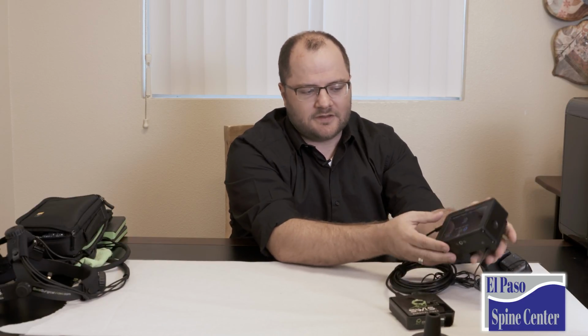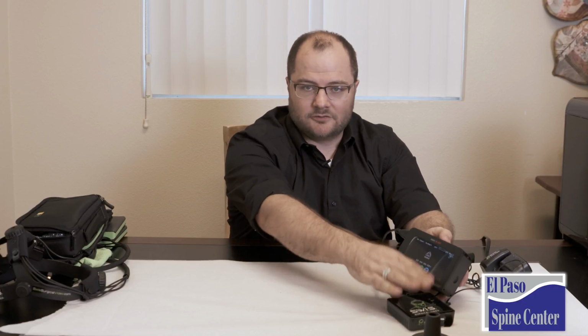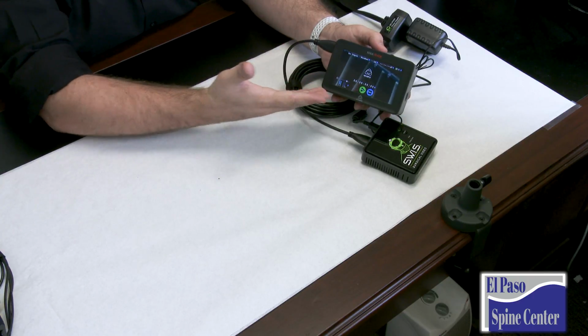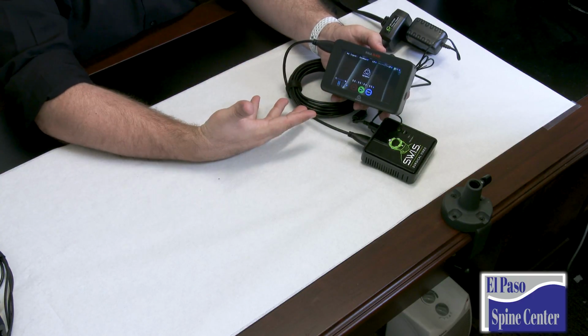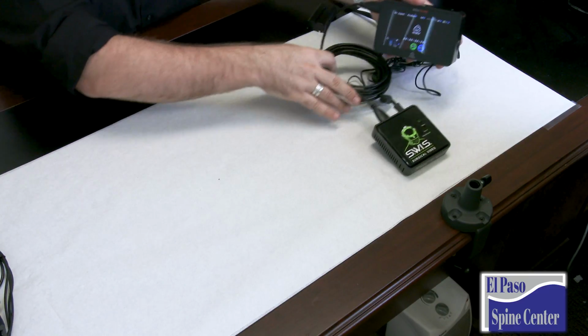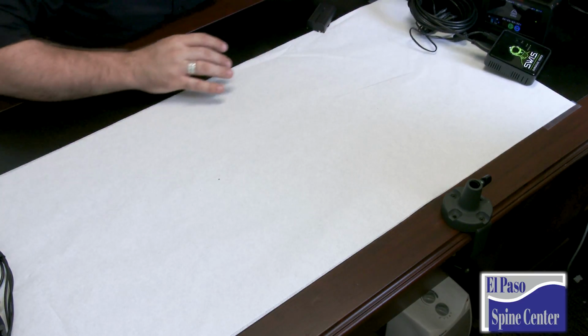But I'm going to plug in the HDMI, and for the moment, we're not getting anything because we don't have any signal going to our wireless receiver. So we have our wireless receiver and recorder set up, but we're not receiving anything because we haven't set up our wireless transmitter yet. So let's set these aside for the moment. I'm going to leave those right over here.